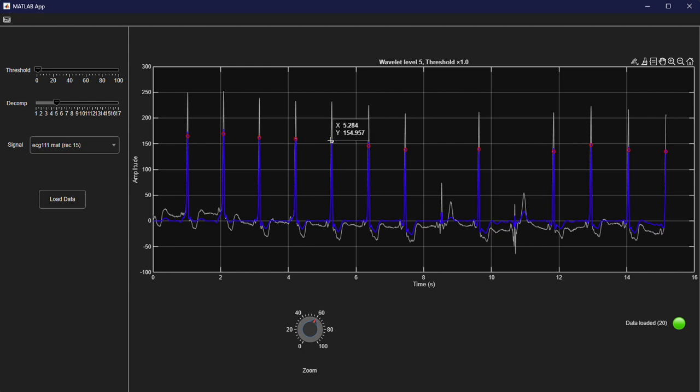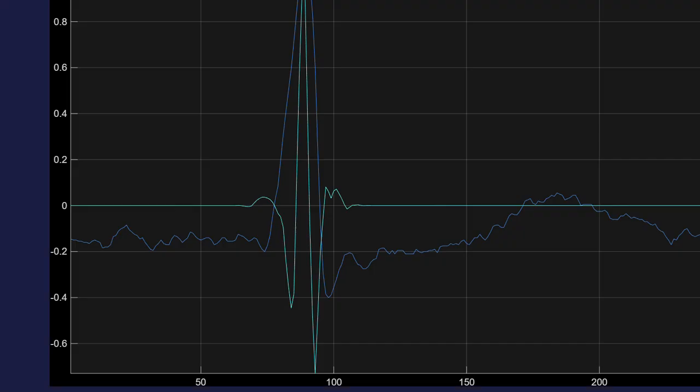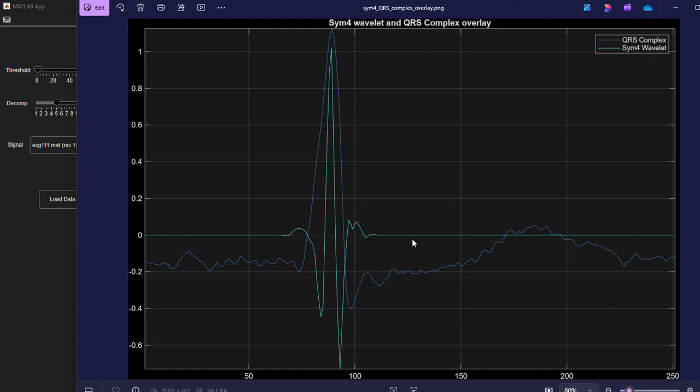So how we arrived at this processed wave is by applying a maximal overlap discrete wavelet transform using the sym4 wavelet. So we can see here the sym4 wavelet closely resembles the QRS complex, and that would be the blue signal here. We apply the sym4 wavelet and decompose the raw signal.